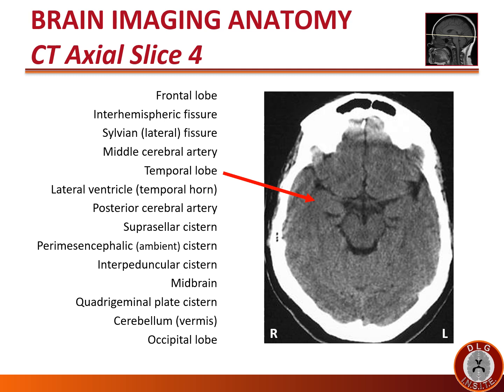At this level laterally we see the temporal lobe. If you see the sylvian fissure on an axial image, just dorsal to it will be the temporal lobe. The small slits of black CSF space in the temporal lobes are the temporal horns of the lateral ventricle. In normal patients, these temporal horns are very small. They only become enlarged with diffuse atrophy of the brain, focal atrophy of the temporal lobe, or when there is compression causing hydrocephalus.